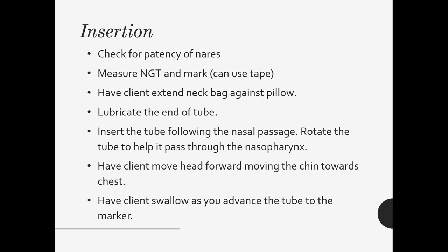And then once you get to the back of the throat, usually at this point you'll feel some resistance and the patient will also probably start to cough. This is when you have the client move their head forward, moving their chin to their chest. Okay? At this point, we're going to give them the cup of water with a straw. We're going to have them swallow as we advance the tube, okay? So we're going to have them take small sips. As they swallow, we're going to advance the tube. So we're going to say swallow, advance, swallow, advance, okay?